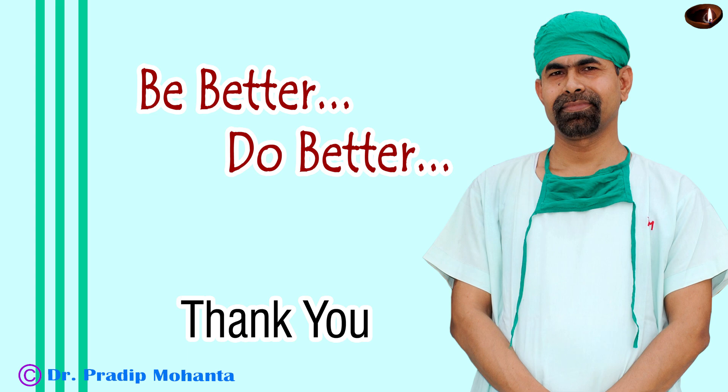I hope this video will help you in developing your surgical skills. Along with pterygium we can do the bare sclera technique of pterygium surgery initially — recurrence is very less. And in a few cases when recurrence occurs, we can do surgery with conjunctival autograft.